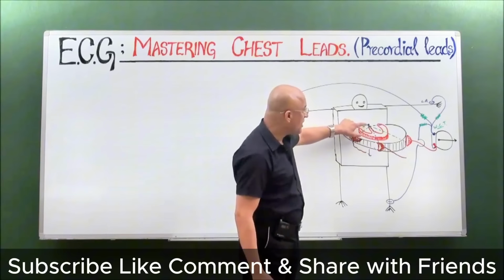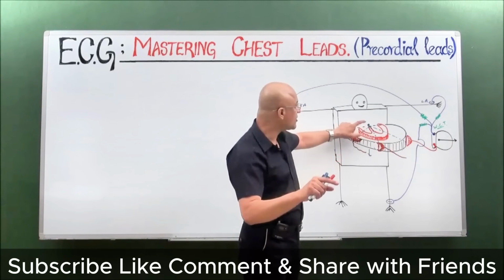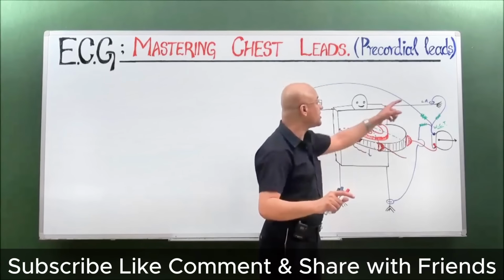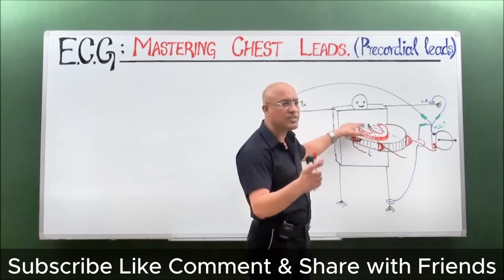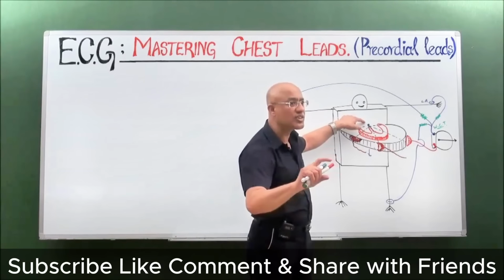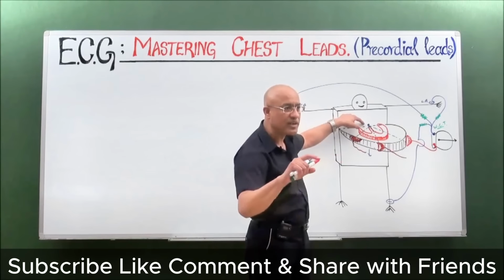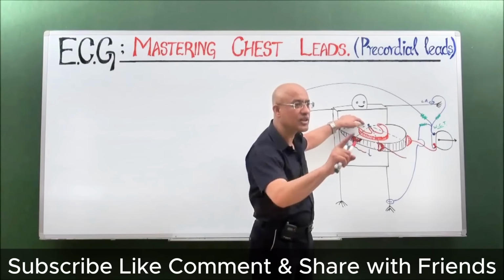Because when the electrical potential of, suppose, atrial depolarization is produced, it is transmitted in the same way to these 3 points. Ventricular depolarization is more powerful, but it is transmitted in the same way. So it is almost always kept zero. We say not only is it near zero, it is constant. The potential of the virtual electrode does not fluctuate significantly throughout the cardiac cycle.